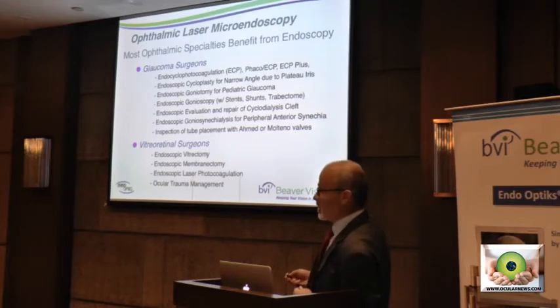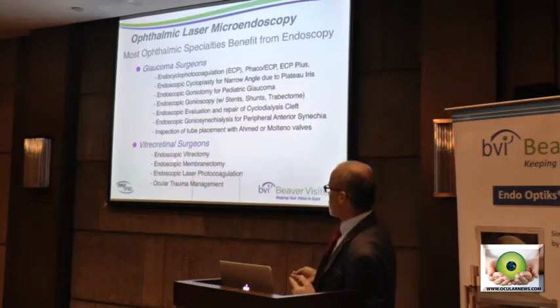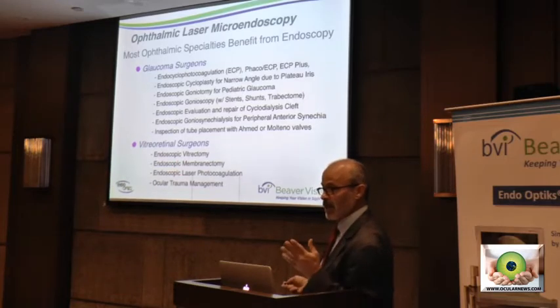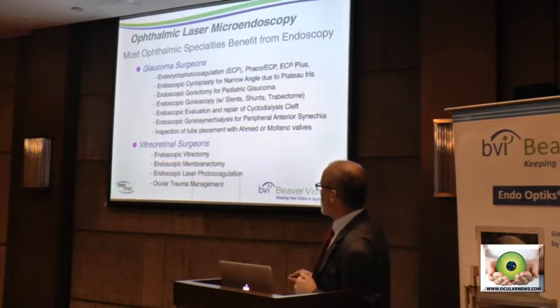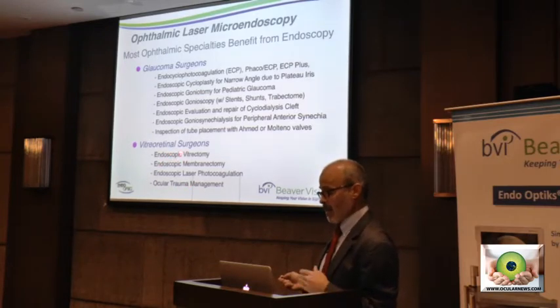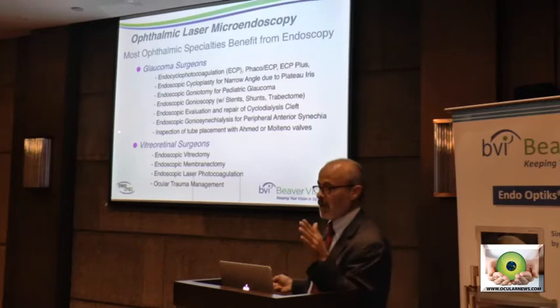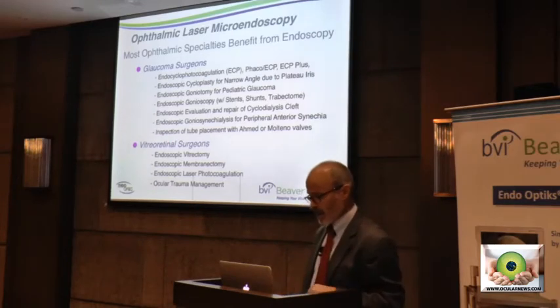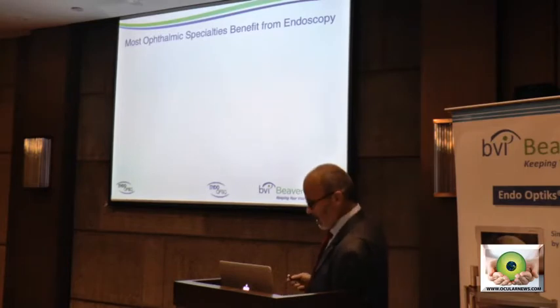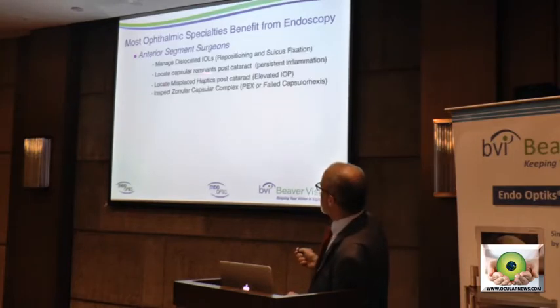Vitreoretinal surgeons have embraced endoscopy: endoscopic vitrectomy, membranectomy, PRP endoscopically. I'll show you examples of that. And in ocular trauma management, it's really represented a breakthrough in managing severe ocular trauma accompanied by media opacities or corneal opacities. Anterior segment surgeons are using it as well, as I mentioned, in complicated cataracts, managing a dislocated IOL.